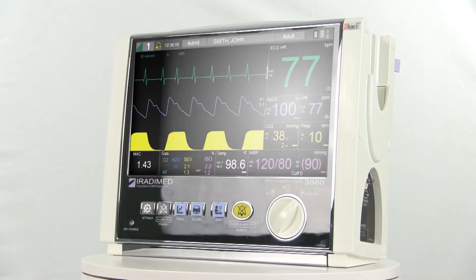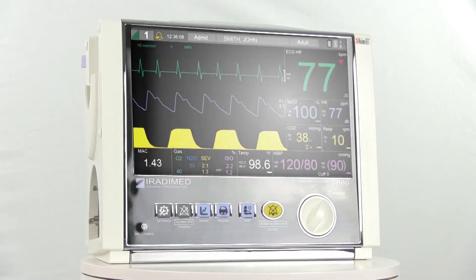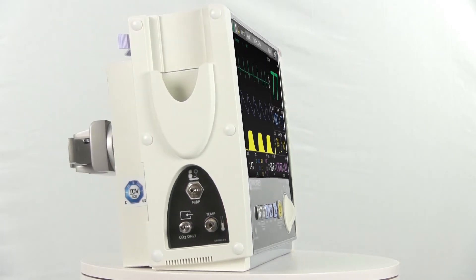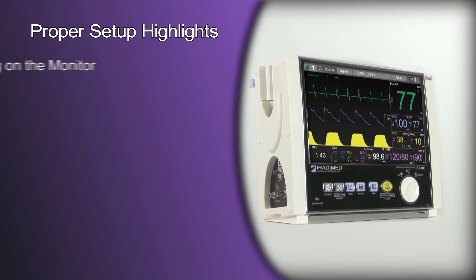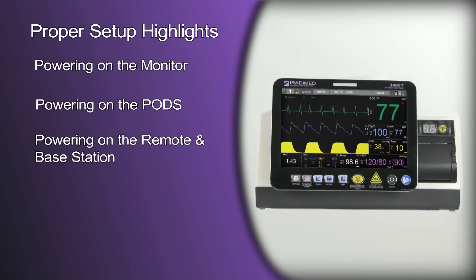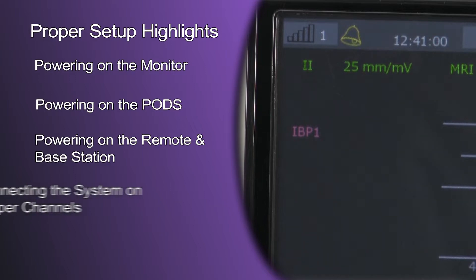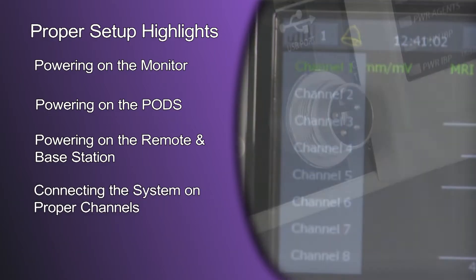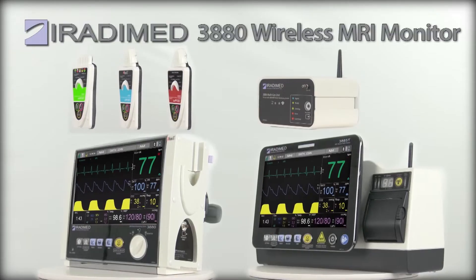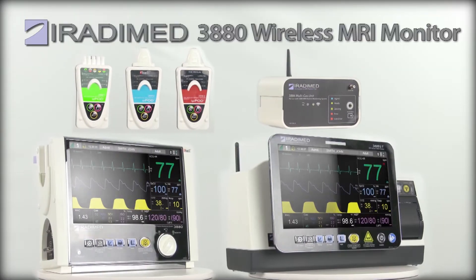Today we are going to review the essential steps into setting up the 3880 MRI patient monitor system. This will ensure patients will have a seamless care cycle during their time at your facility. This video will focus on powering on the monitor, powering on the pods, and finally powering on the wireless remote and its docking station. We will provide step-by-step instructions on how to connect the system on proper channels, and finally connecting devices to their power supply and proper charging practices. This video series will focus largely on the features found on our top tier device, and your device's features may vary.